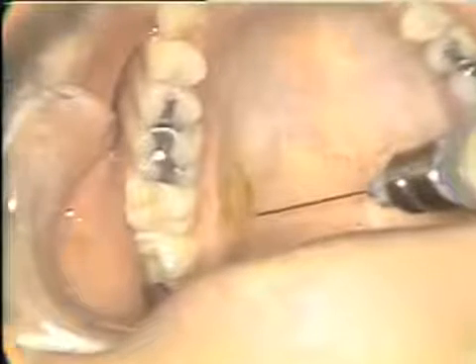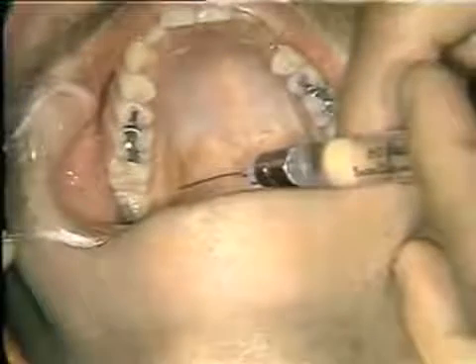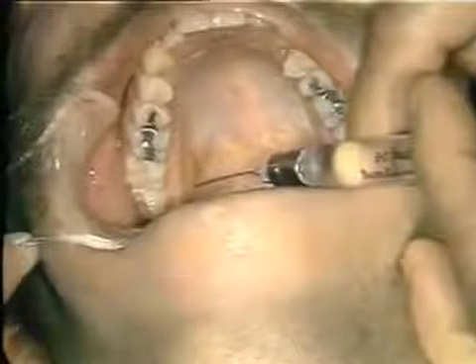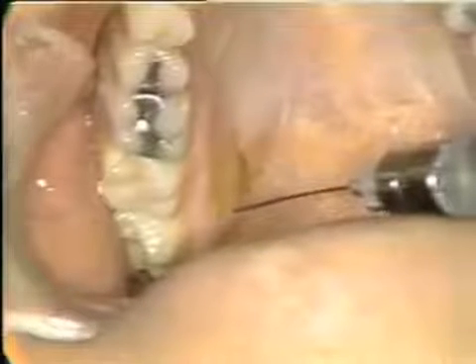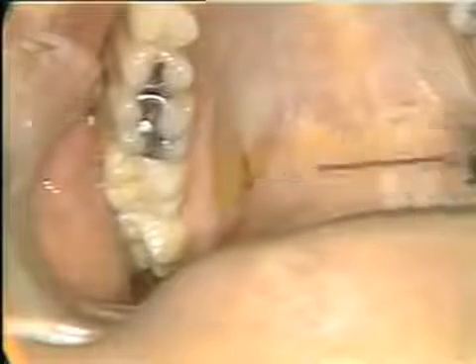Now you can see I'm at about at a level of the third molar. And we make our puncture and carry our needle bevel clear to bone. Then we aspirate, and again in the usual fashion. And then we expel a few drops, up to a quarter of a cc if you can. And I can see those tissues blanching a little bit. I don't know whether you can see it or not, but we are getting some solution out into the tissues. And we know that we have accomplished our mission, and then out quickly.